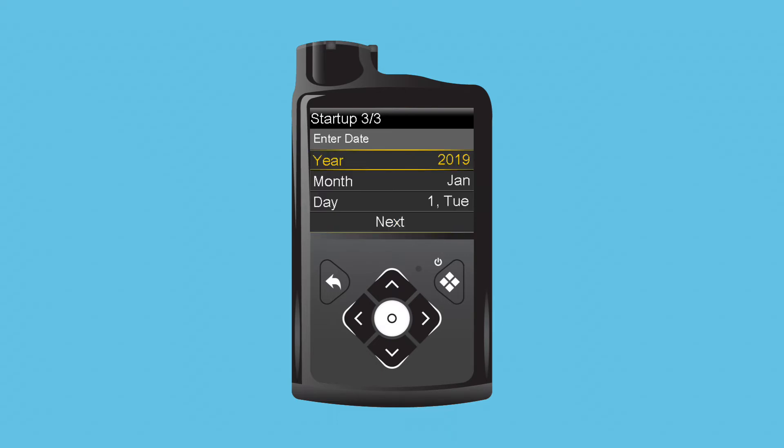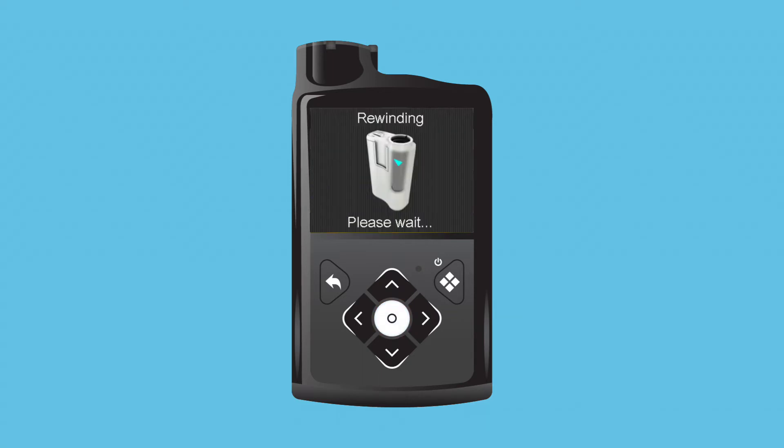On the next screen, year is highlighted. Clara selects the correct year and moves on to month. She selects month and uses the arrow to choose her current month. She presses Select and selects day. To finish, she selects Next. She sees the rewinding screen briefly appear and receives a message confirming that her initial setup is complete. She selects OK.